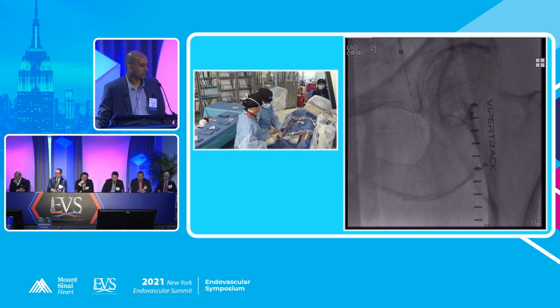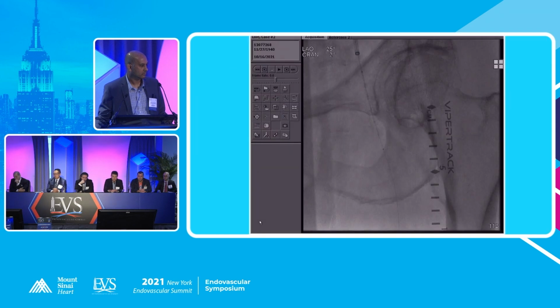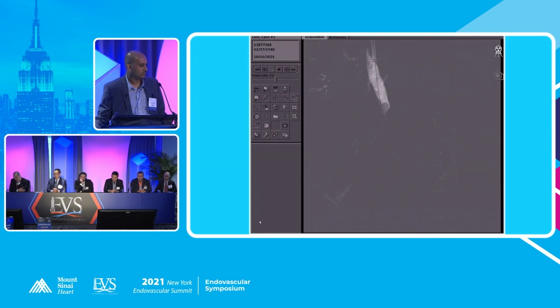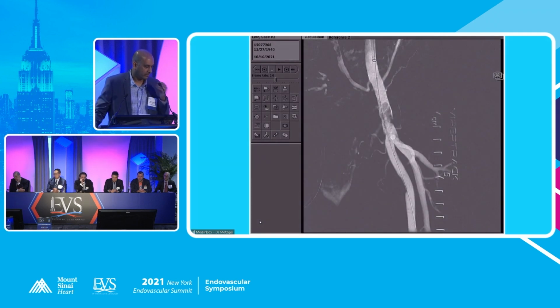Go forward. Okay, stop. Now, what we're going to do now, let's do a roadmap, please. All right, what we're going to do now is find out where that common femoral artery is with a roadmap. You ready? I'll tell you when to inject. Inject.